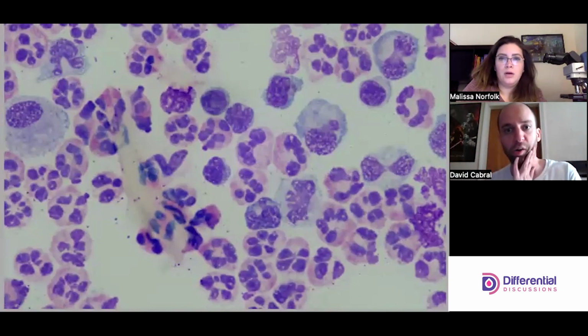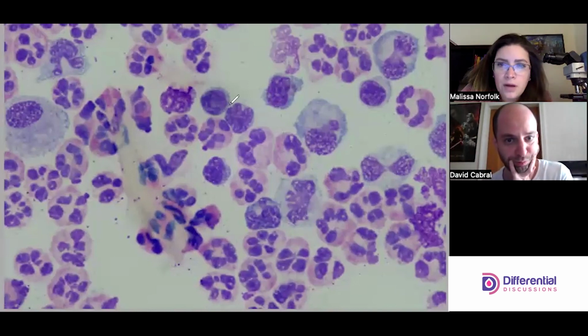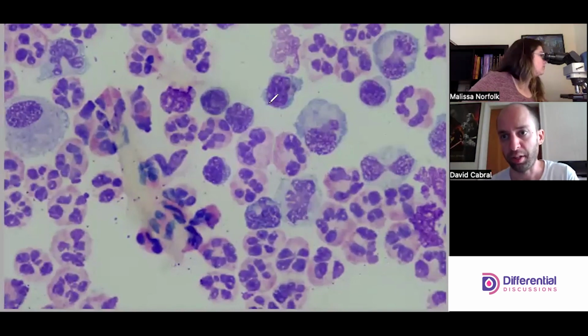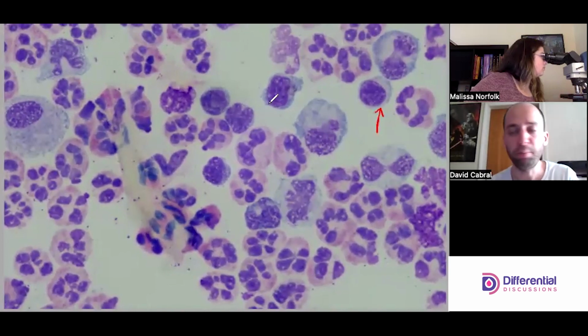I think we have a lymph there, a lymph here, and a lymph here. We got another one up here too, I would argue, and then maybe this is another one.